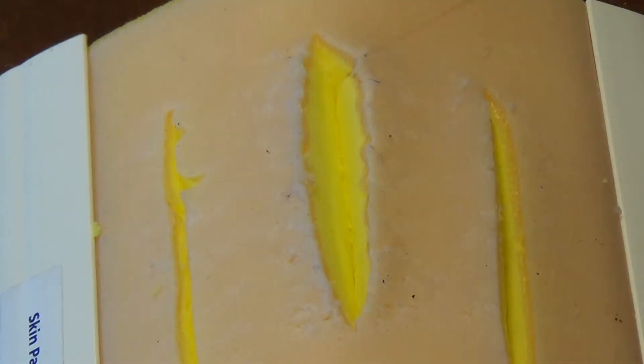You can see I started a bit downstream from the apex. So I'll need to go back through that apex to ensure good tissue apposition.